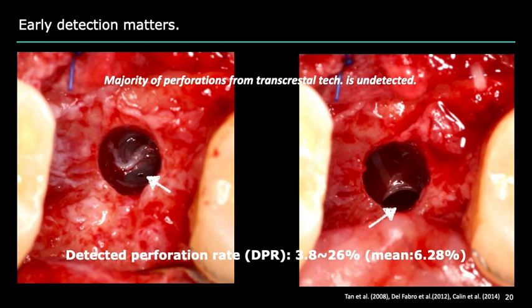In this case, I didn't magnify this picture and gave a hydraulic pressure to lift up the membrane, but I was not able to get back pressure pushing the piston. On your left-hand side, there is a really tiny perforation, but I was not able to recognize that small, tiny perforation at first.